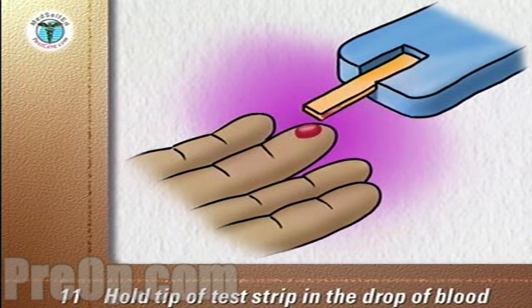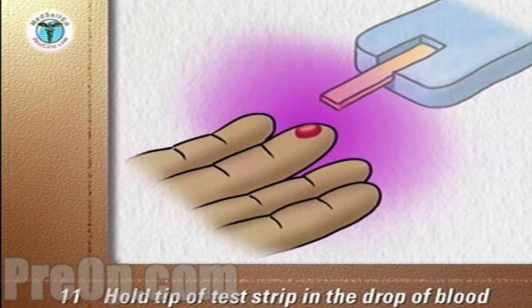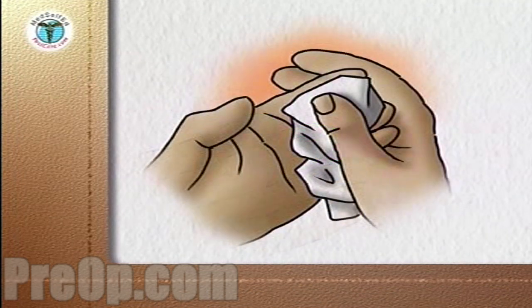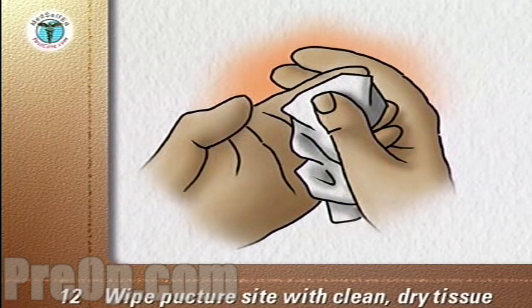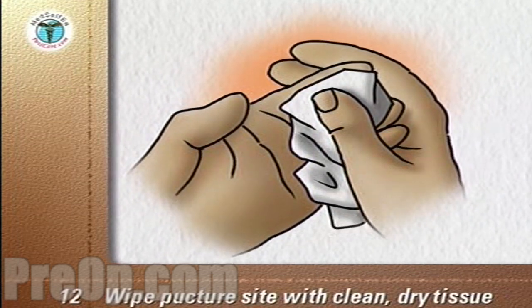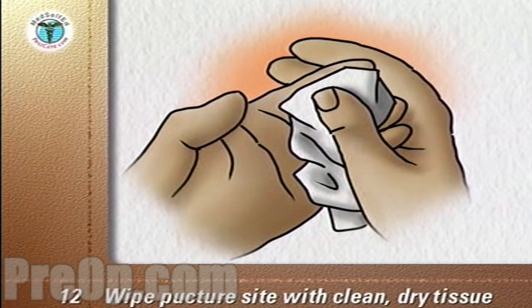Put the device and the strip aside until the reading is complete. Wipe the puncture site with a clean, dry facial tissue and use the tissue to hold pressure on the puncture site until the bleeding stops.